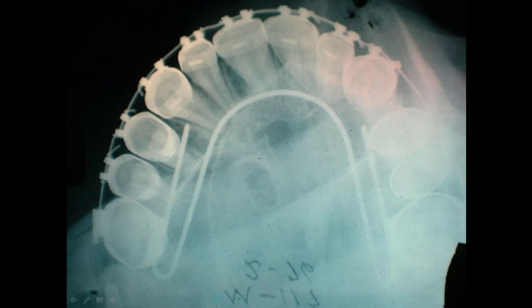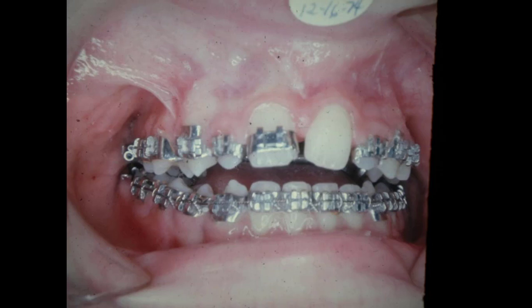Whether she was missing this six-year molar or they removed it, I don't know. But she had no six-year molar, but she did have a wisdom tooth, so we brought it forward. During the separation, the bite opened because we pushed the cusp up on top of the other cusp.